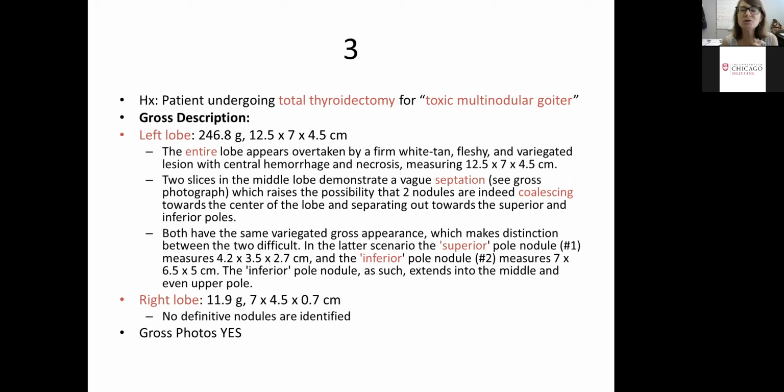Because usually there's something else, right? As we saw in the prior 2 cases, there were either an FNA, there was some ultrasonographic findings of a dominant nodule, right? So if you tell me this patient had a goiter, I think you didn't go into the medical record to read anything about this patient. So just letting you know.